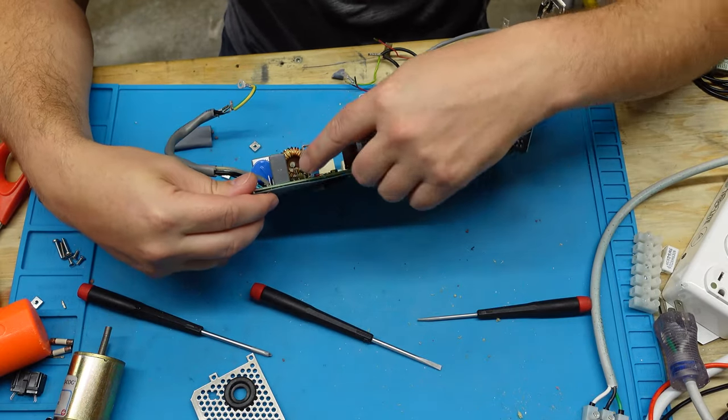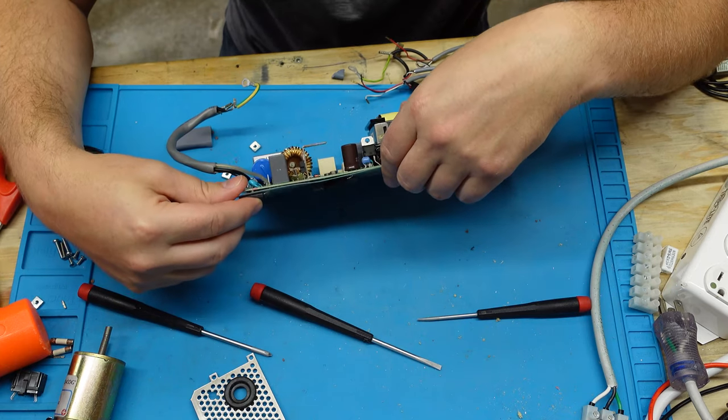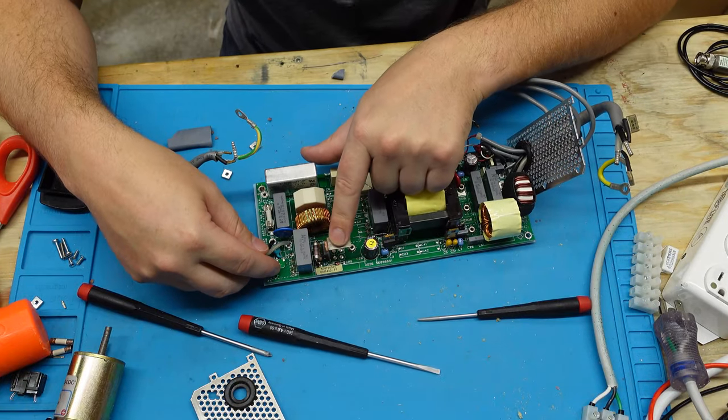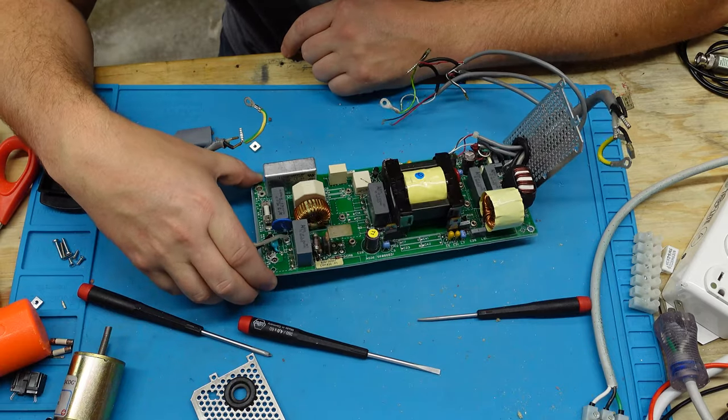But yep, just two wire-wound resistors in parallel. And I honestly don't know if those are being used as a shunt to help this figure out its value or what. But yeah, that's it.